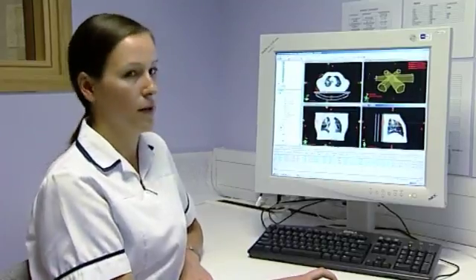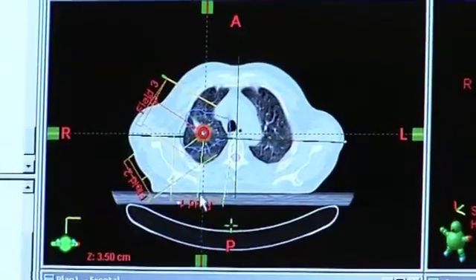For this treatment we're going to apply three beams: a right post oblique, another right post oblique, and a right anterior oblique.